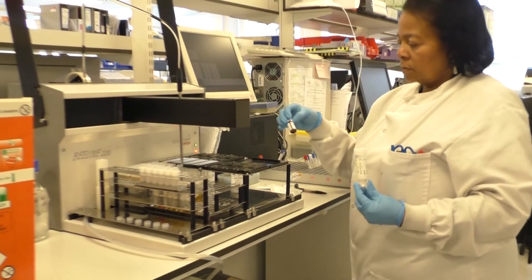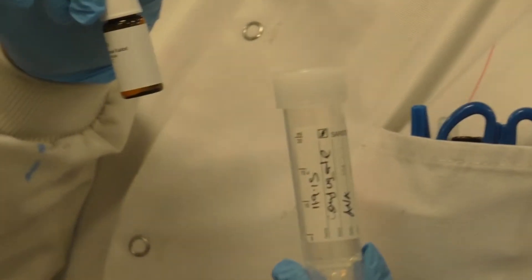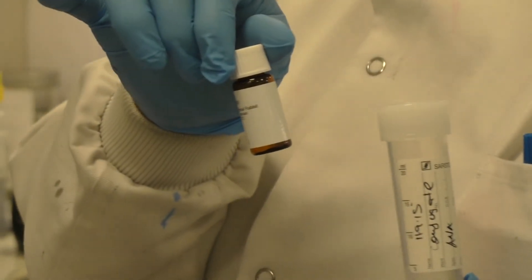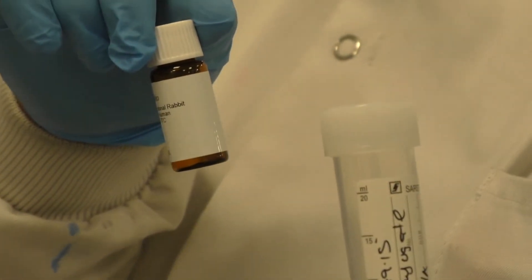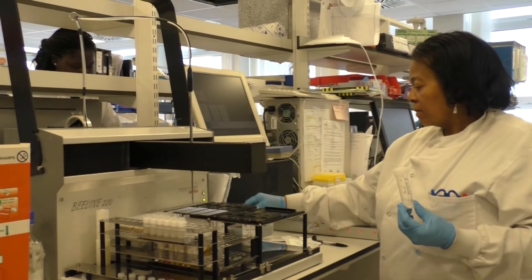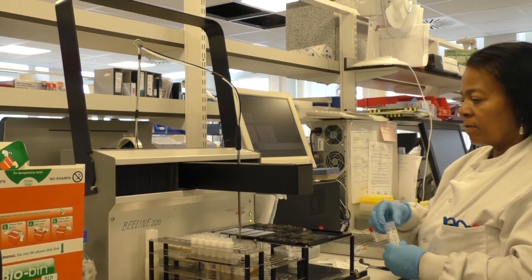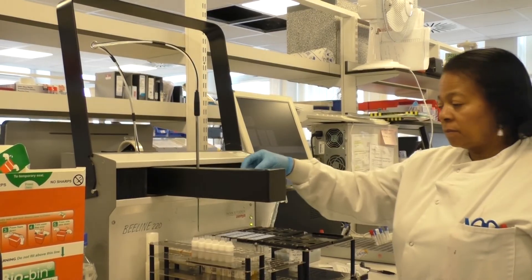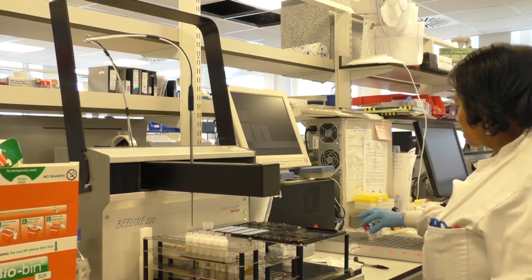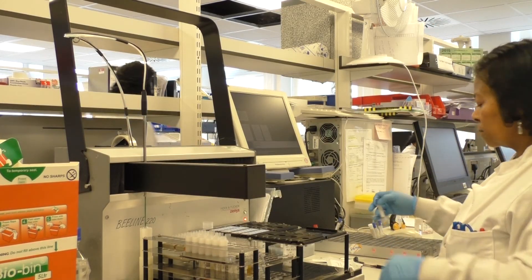The sample conjugate is diluted fluorescein isothiocyanate, which is a FITC solution. The concentrated FITC solution is diluted to the correct concentration and placed in the machine in a pre-calibrated position on the reagent rack.